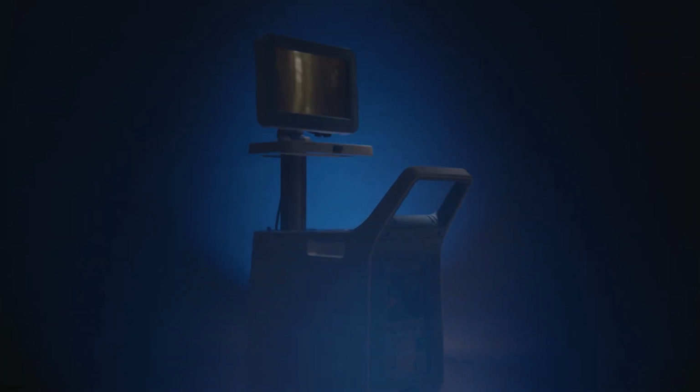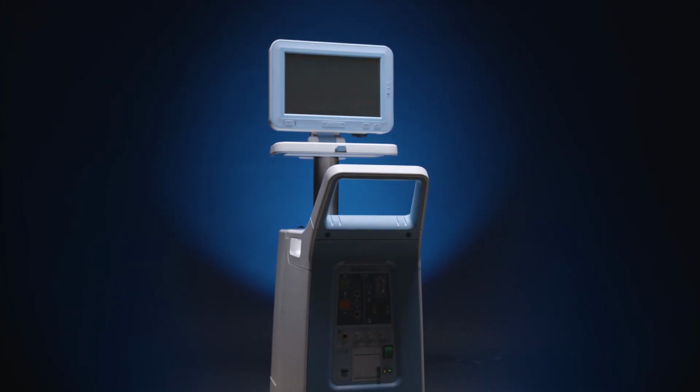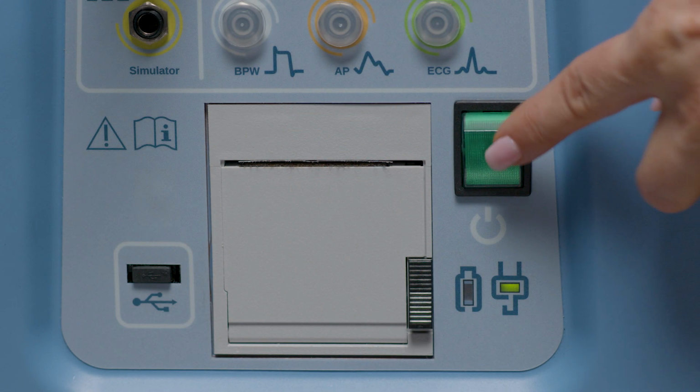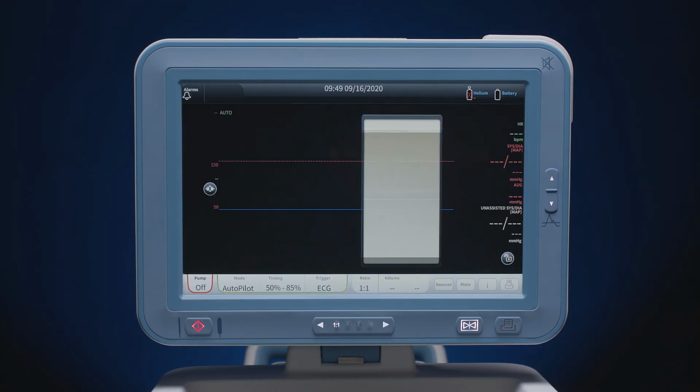This video will review the basic startup of the AC3 Optimus IABP for fiber optic IAB insertion. To ready the pump, connect AC power and turn power on. The AC3 Optimus series system starts up in autopilot mode by default. When powering on the pump for the first time, the Getting Started checklist will display.